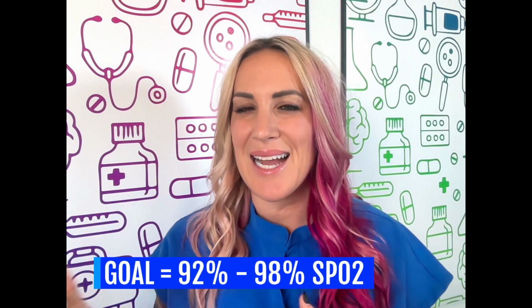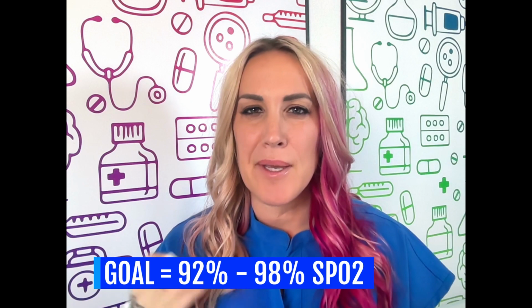Usually this makes them sleep a lot better because this sickness requires this oxygen and they can finally get some rest. And we want to remember that no matter what we're doing, we always want to strive for 92 to 98% of our SpO2 or pulse oximetry reading.